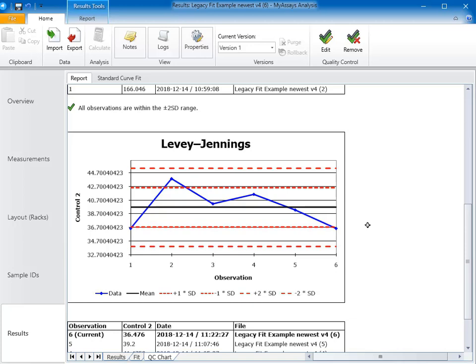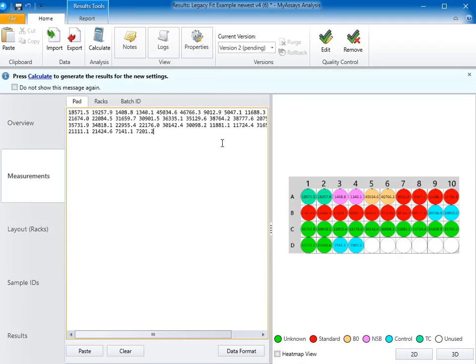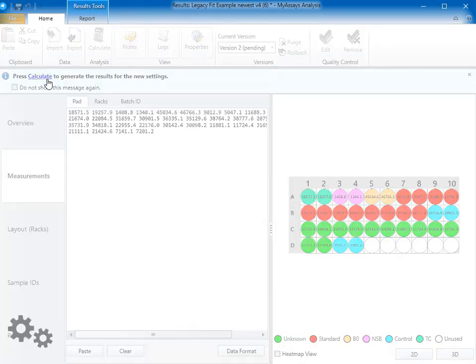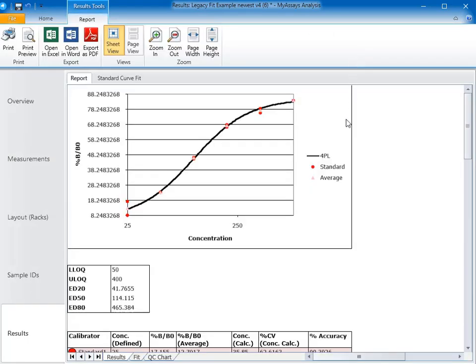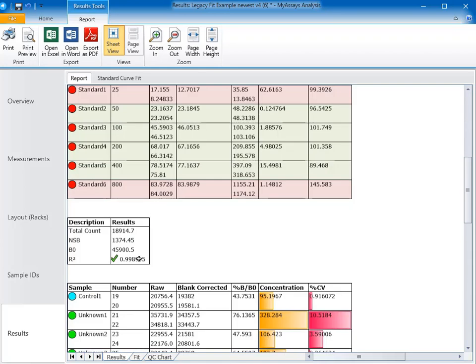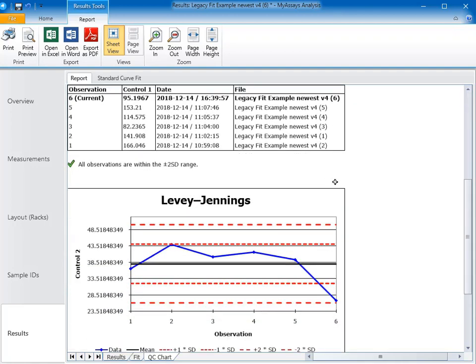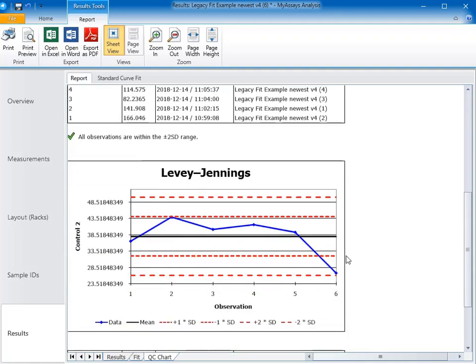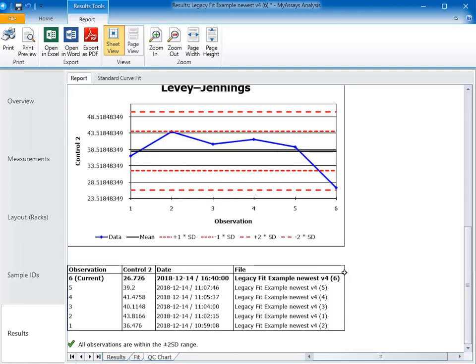I have another set of data to view, so let's go ahead and import that data now. Looking at our curve fit, the data still looks OK, but I think we may have an outlier in Standard 1. The R squared is still acceptable, and it looks like our QC is still between the mean and 2SDs, even if only barely on control 2.